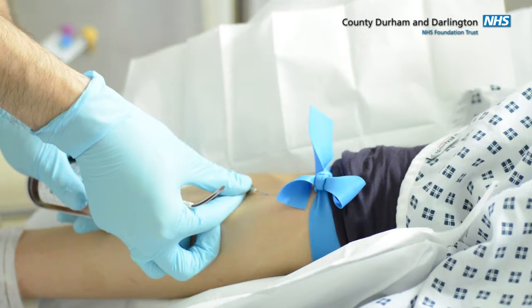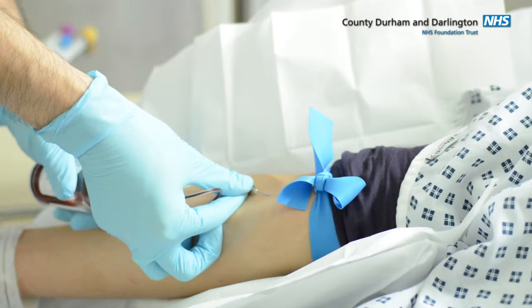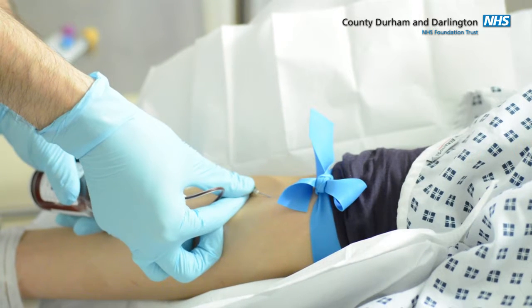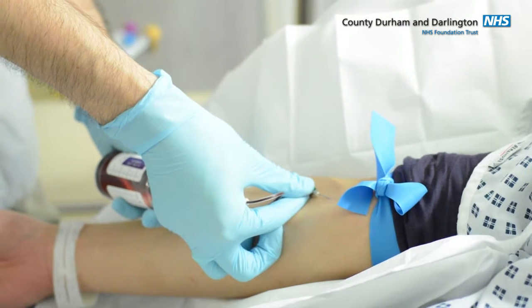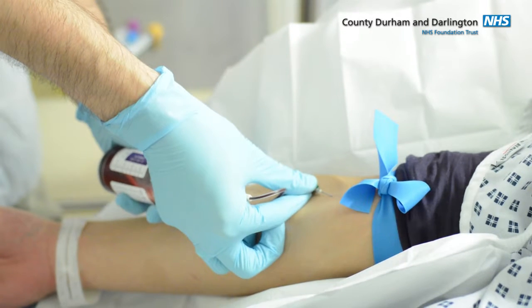Collect first the blue aerobic bottle and then secondly the orange anaerobic bottle. For adults, you need to take about 8 to 10 mils of blood. For children, 3 to 5, or neonates 1 to 2 in each bottle. If any additional blood samples are then required, they then should be sampled last of all.